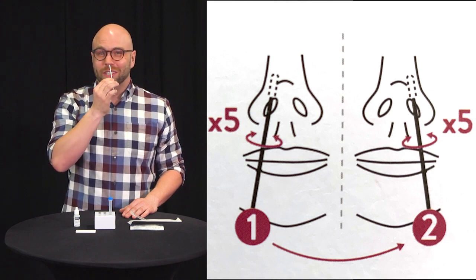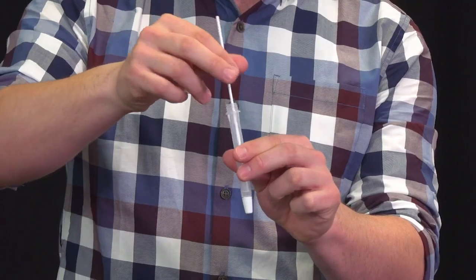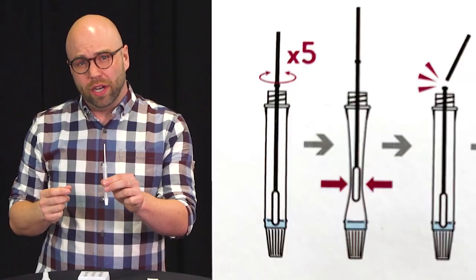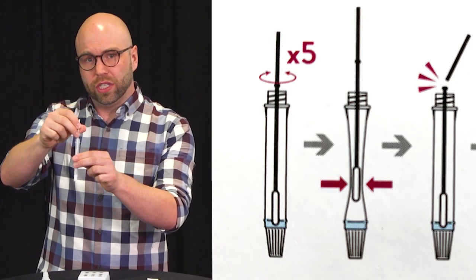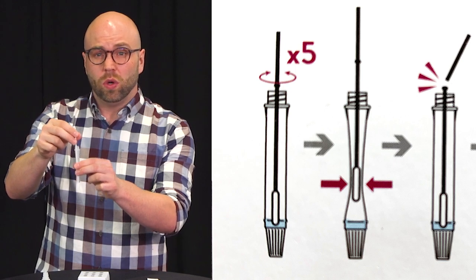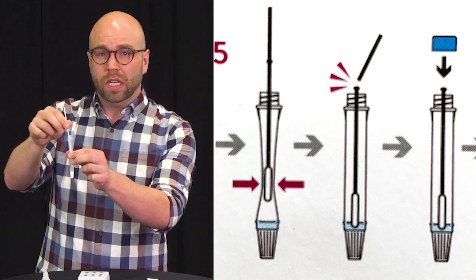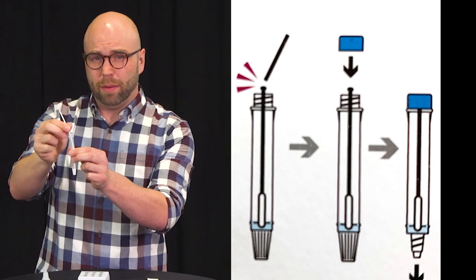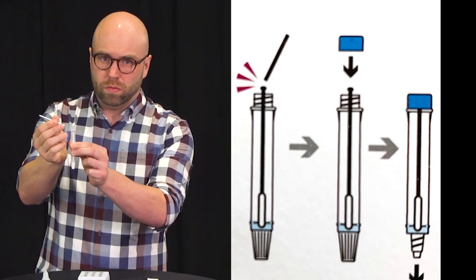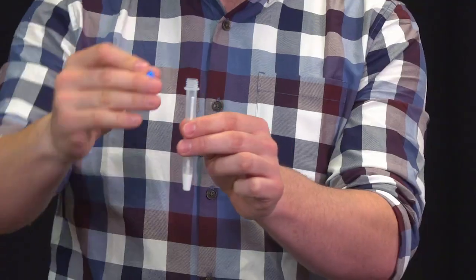Making sure that it stays in the nostril for at least five seconds. Now for the other nostril — spin it around, twirl it, make sure that it stays in for at least five seconds. Once completed, take it out and drop it into the vial. Swirl it around five times in the vial, pressing the swab against the edges to make sure you squeeze any of the elements from the swab into the buffering agent. Hold onto the tube and pull the swab up slightly so you can squeeze the end of the swab. You'll notice that there's a break point on the swab — simply snap it off and allow the swab to fall back into the buffering agent. Put your lid on the vial and it's ready to test.